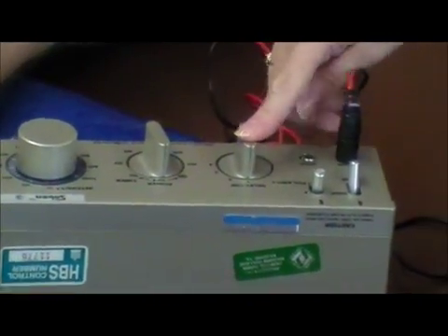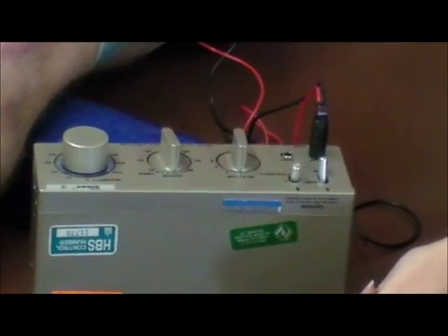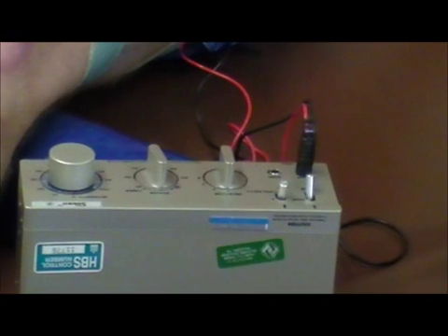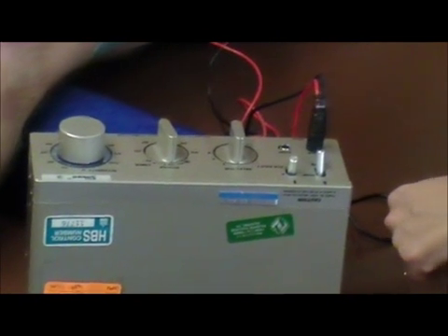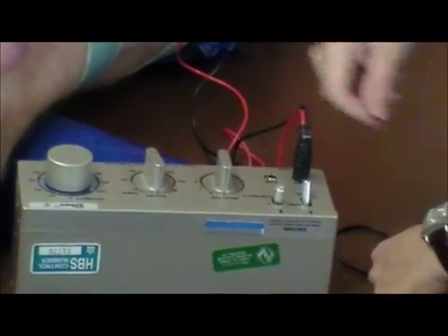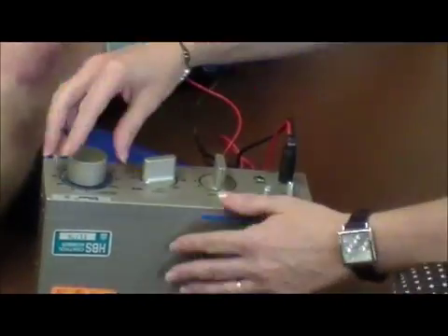So this first one is going to be continuous high rate. We're going to go for a motor response so you see it. So you have to sometimes palpate and look instead of just looking here, because once it contracts, that's it. You miss that contraction, you missed it. He'll feel it first. It'll wiggle, wiggle, squiggle, squiggle, and then it'll... Are you ready? Okay. Time.